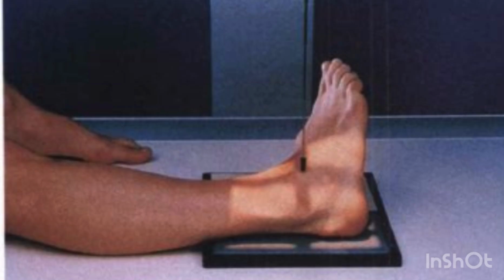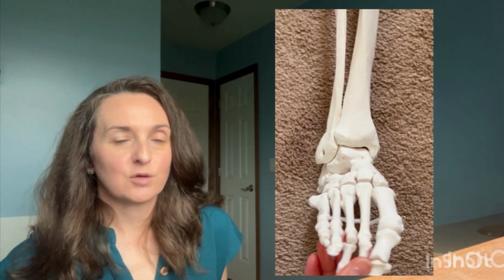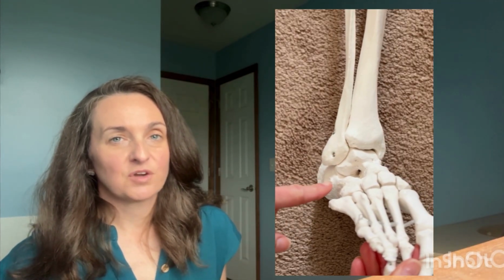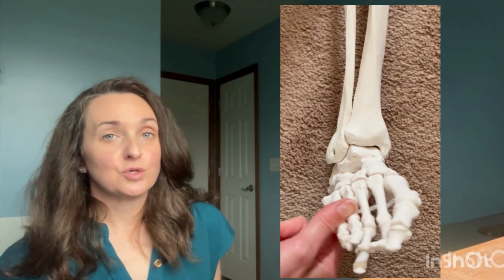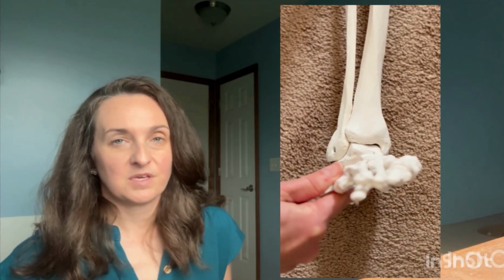Make sure that the patient keeps their ankle dorsiflexed for the Mortise view. Otherwise, the calcaneus will superimpose the ankle joint space. Be sure that the patient does not dorsiflex their ankle too much. If they do, then their toes will superimpose over the important ankle anatomy.